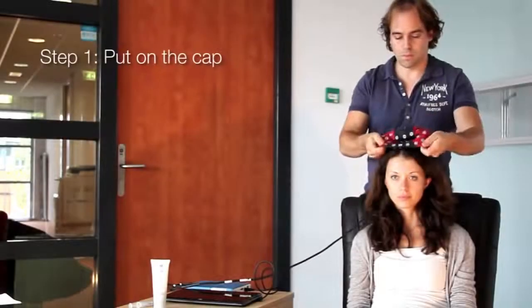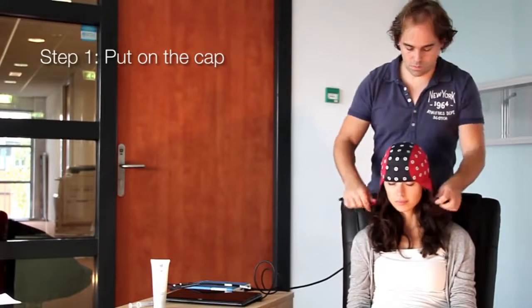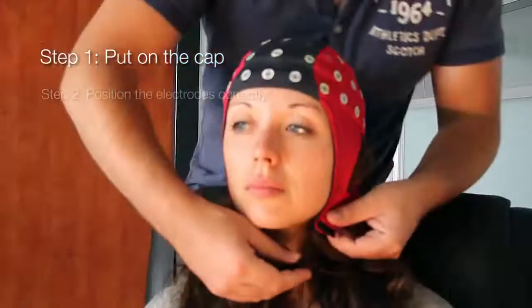Place the frontal electrodes on the forehead first and then gently pull the cap back and over the head. Fasten the cap using the chin strap.